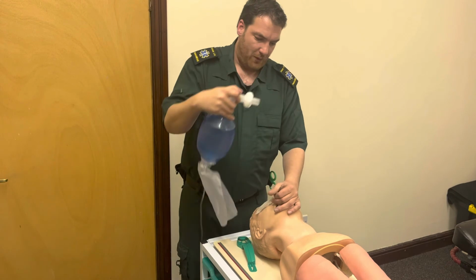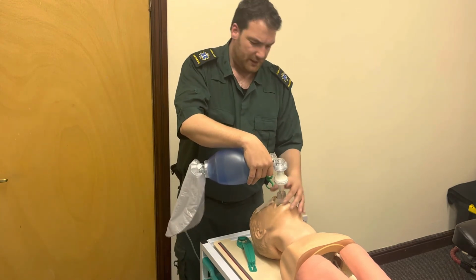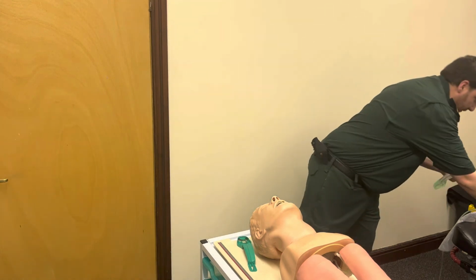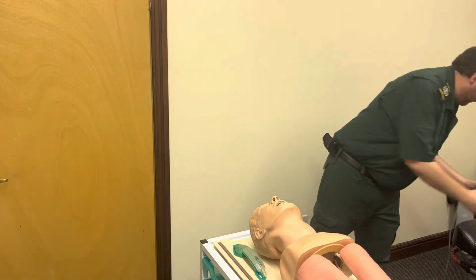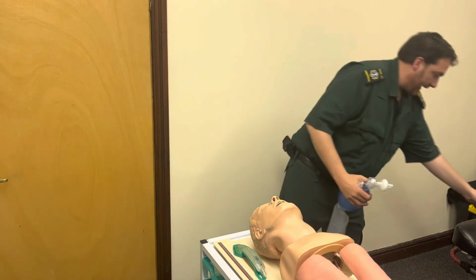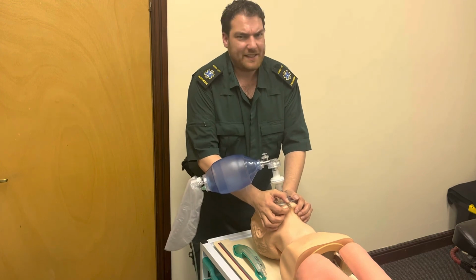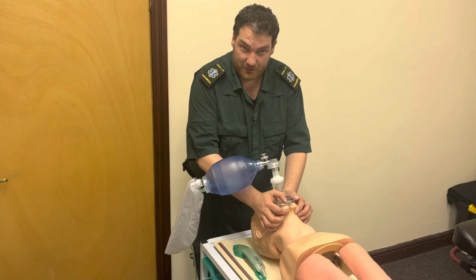Now, keep in mind, if it hasn't worked, so let's say I've tried to do it and I've tried to get it to work and it's not working, so I would try and take this off. Let's say air's not going in, all right? I'll take it out, and if worst comes to worst, try and keep this aseptic if it's okay. And I will then either try with an OP airway, which I can do, go back down, or like I had with Dan earlier, I can do the 2-person technique, like so. Whatever works. Don't be too fixated on one specific airway, okay? Do what works. Thank you very much.